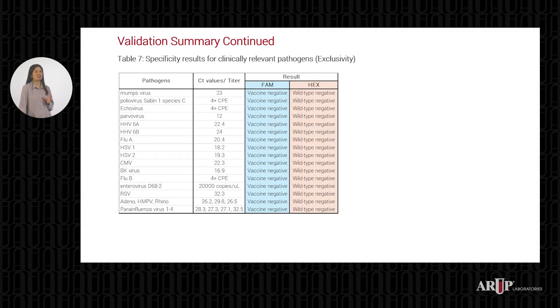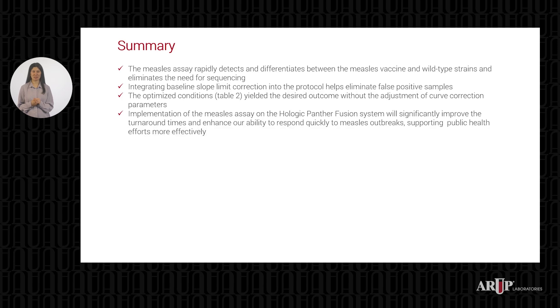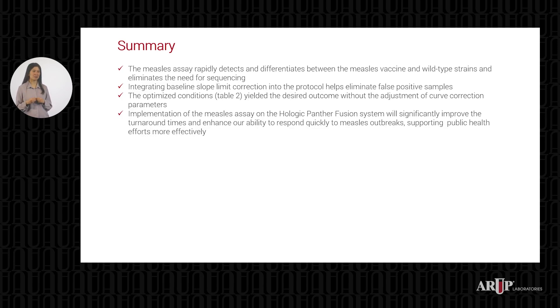Before we wrap up, I want to highlight some key points. The measles assay allows for rapid detection and differentiation between the measles vaccine and wild-type strains, eliminating the need for sequencing. We discussed two approaches to address false positive samples: in the first approach, integrating a baseline correction slope limit helped eliminate those flatter-looking curves near the FAM baseline; and in the second approach, optimized assay conditions yielded the desirable outcome without adjustment of analysis parameters. We believe that implementation of the measles assay on the Hologic Panther Fusion system will significantly improve turnaround times and enhance our ability to respond quickly to measles outbreaks.